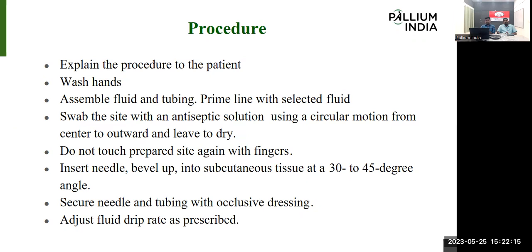For cleaning, use a circular motion from the center. Center means the pricking part, so clean from the center outward in a circular manner. After cleaning, leave it for 2 to 5 seconds for drying. During drying, or after cleaning with the antiseptic solution soaked swab, don't touch that area again with our fingers, because we need to keep that area very clean.